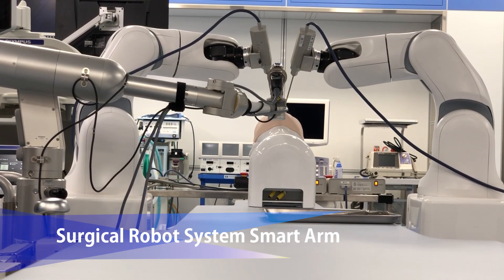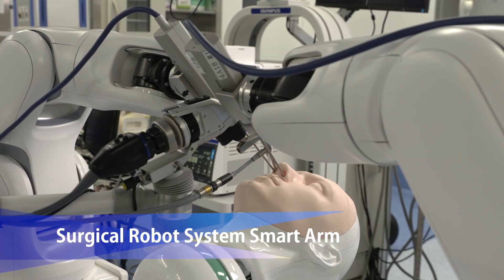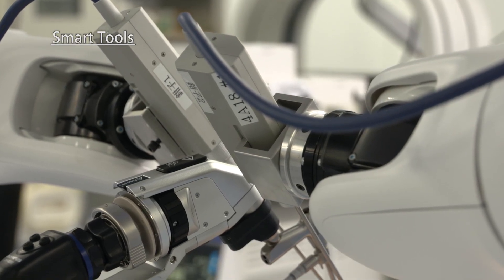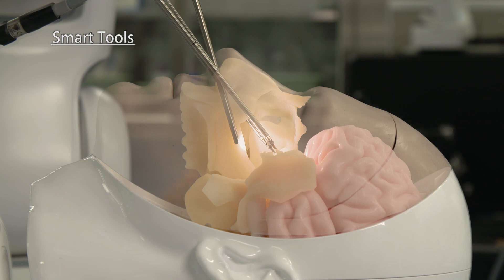Smart Arm is a cutting-edge neurosurgical robot developed through utilization of the bionic brain model. A pair of smart tools and an endoscope are inserted from the nostrils and used for endonasal suturing of the dura mater.